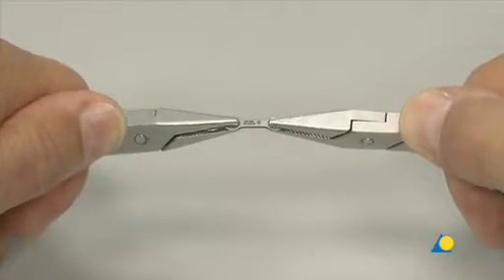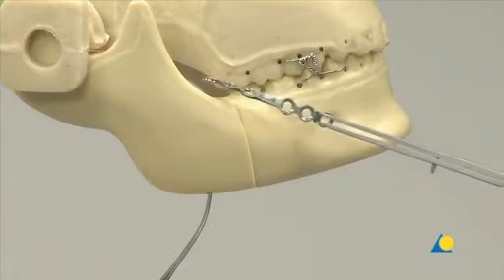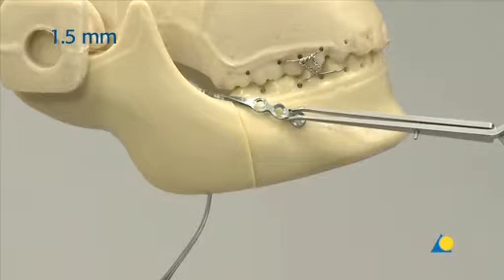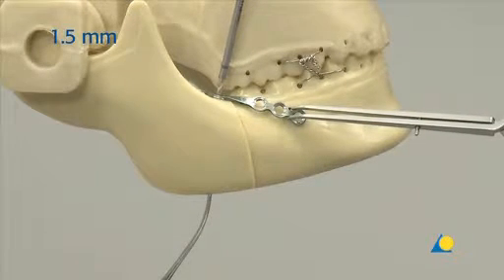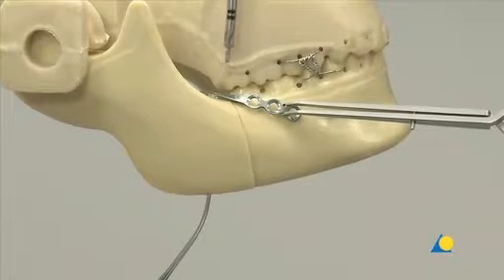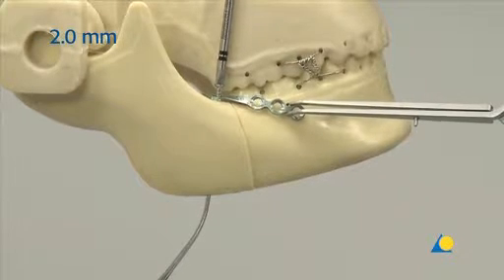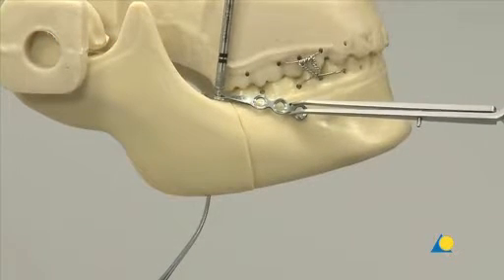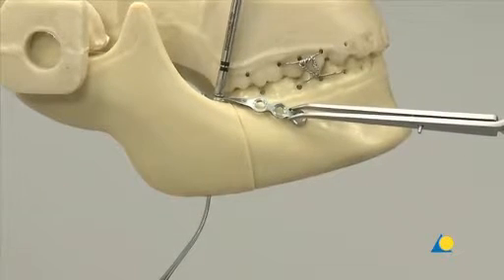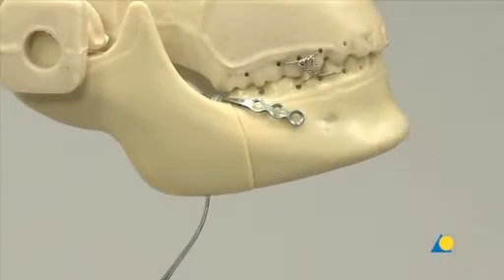The plate is contoured with bending pliers to match the anatomy. The first hole is drilled monocortically posterior to the fracture using the 1.5 mm drill bit with 6 mm stop. The drill should be held at approximately 90 degrees to the plate and bone surface. A 6 mm long 2 mm screw is inserted, but not fully tightened, to allow for any plate adjustment. The screw placed into the proximal fragment allows the condylar bearing fragment to be reduced with the help of the plate.